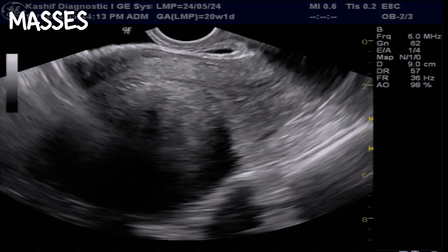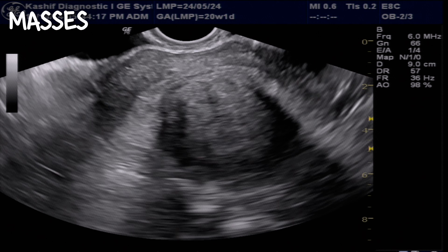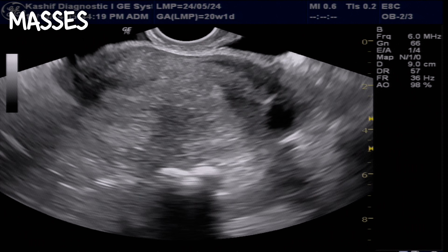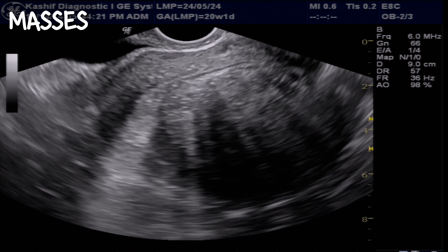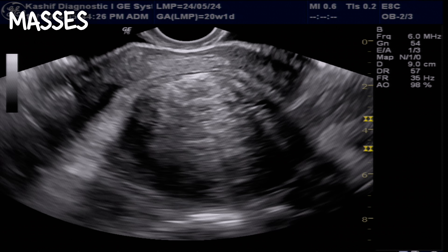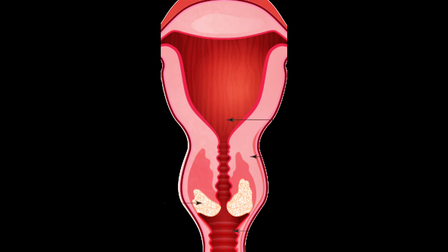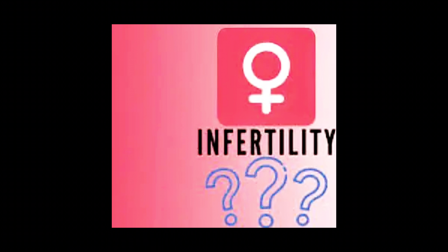Uterine masses can also be detected by ultrasound. The most common uterine mass is benign, such as fibroids, which involve the myometrium of the uterus. Adenomyotic changes associated with endometriosis can also be detected. Cervical, uterine, and malignant masses and growths can also be detected by ultrasound. All these problems can cause complications, infertility, or miscarriages in some patients.